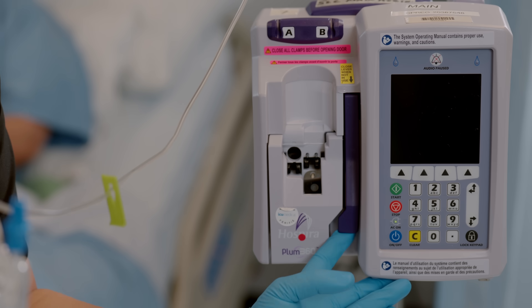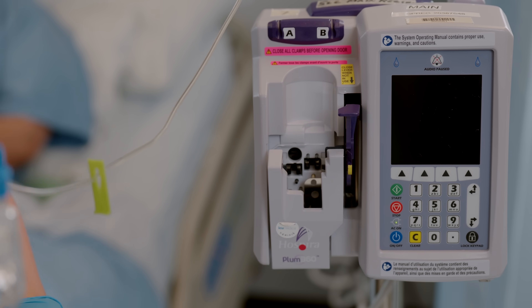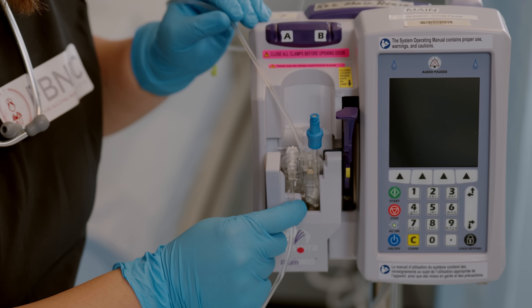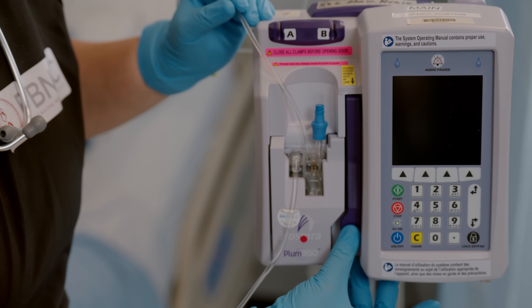Once the tubing is primed, you are ready to load the Plum 360 cassette. Open the lever and slide the cassette into the door, then close the lever door. Now you're ready to program your infusion pump.